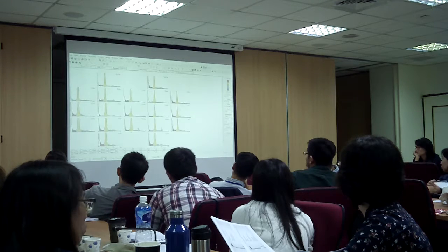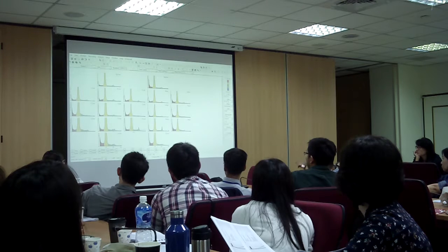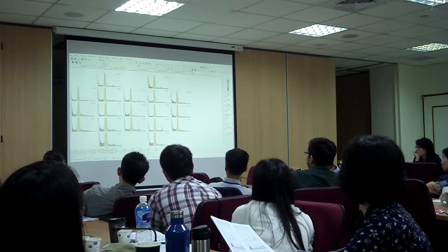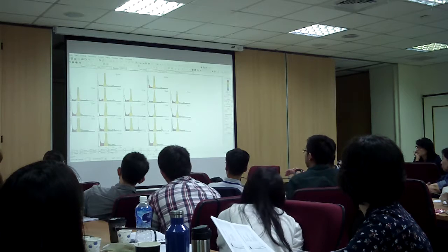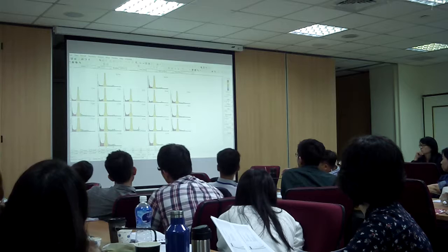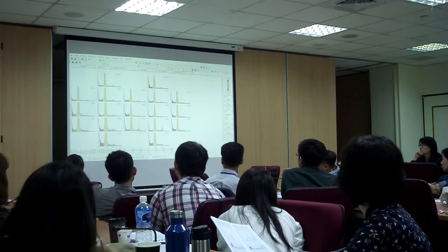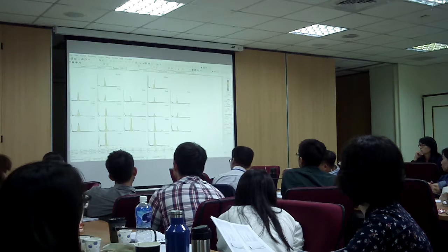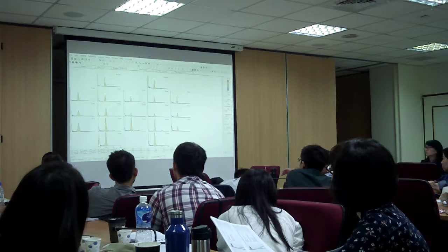And we are going to see what we have here. We got 2 to 12. So we suppress 2 to 12 hertz, and we would suppress 20 to 23. This could be EMG. But if it wasn't EMG, if it is real high beta, 20 to 23. So we suppress 2 to 12, 20 to 23, and we uptrain 12 to 15 to get that brain going. We need to jumpstart that brain. When we jumpstart that brain, it's going to start functioning a lot better.